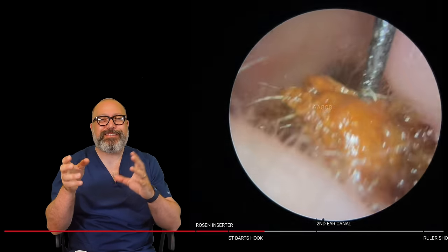And you can see it's really loosened that front end, exactly the same as the other side. This front section here seems to be lots of little bits that are all layered over the top of one another. I had a bit of difficulty getting this next part of the plug away. I think it's because it's connected to a bunch of skin here at the bottom. Hopefully, guys, you were sticking through this one as well. Like I did say at the start, it is a long one.